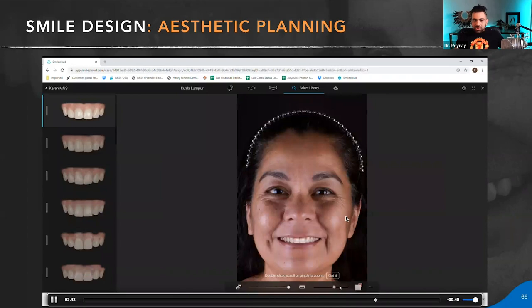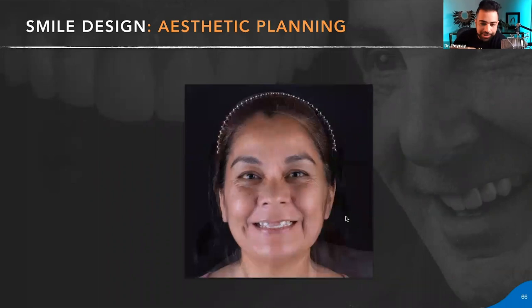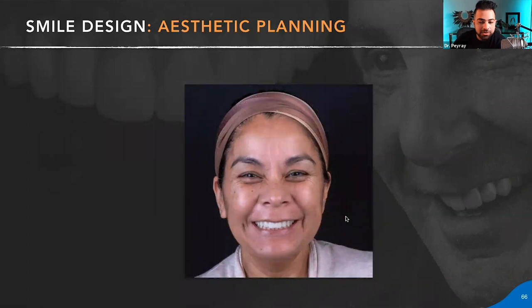So we did the surgery, we did a smile design, and here's the next slide that shows you. This is a GIF that we have. This is the smile design, and here's the final, or the temporary, that she's wearing the same day of surgery. So it's very powerful. It's very close. And I show you how you can download the library and do this either yourself in your office, in your lab, or tell your lab that this is what I want to do.